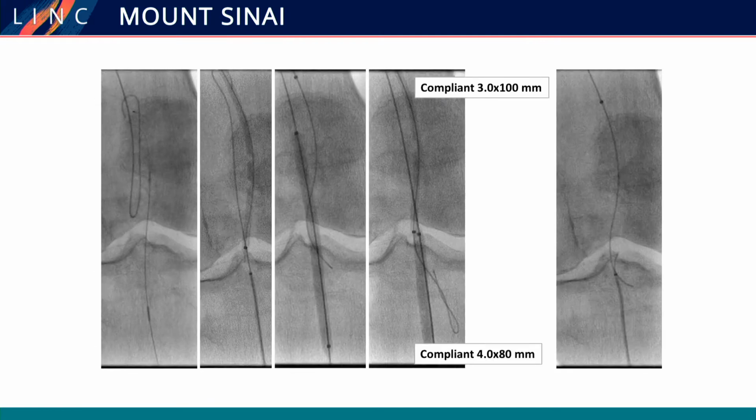So the question is, what do you do in this situation now? And this is the talk basically on reentry. So typically we try with wires first. I'm pushing the wire, trying to see somehow I can make the wires meet, and keep going back and forth. It's not like I do one thing for 10 minutes. As you saw with Andre, you push the top wire, you come back, you do the retrograde wire, you keep doing that, and after a couple of minutes you realize, okay, this is not going to work.